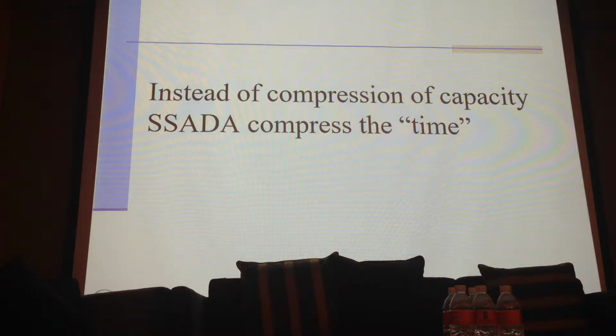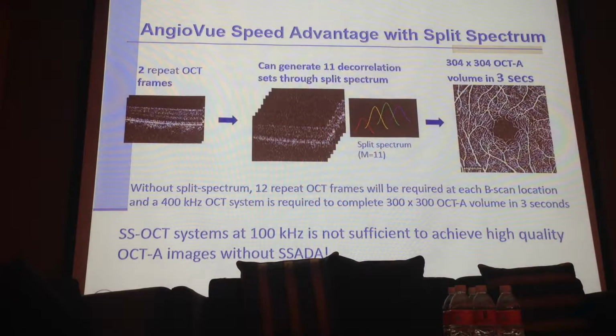But instead of compression of capacity, SSADA compresses the time, not the quality. Is it possible? Is time compressible? I'm not talking about a black hole or wormhole time travel, but actually yes, we can compress time. This is how we acquire an SSADA image.